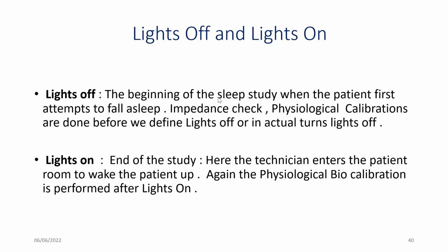Right. So what we are looking at is time in bed. Time in bed, I told you, is between lights off and lights on. What we are actually interested in is sleep efficiency, which will come in the next slide. So we need to define lights off and lights on. What is lights off? Basically the beginning of the sleep study when the patient first attempts to fall asleep.